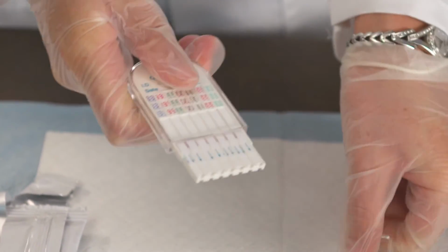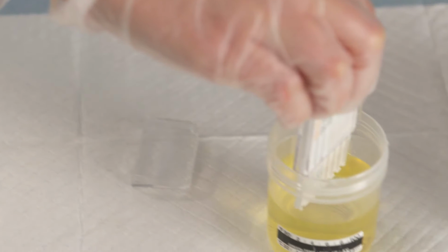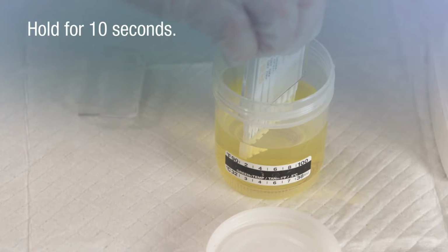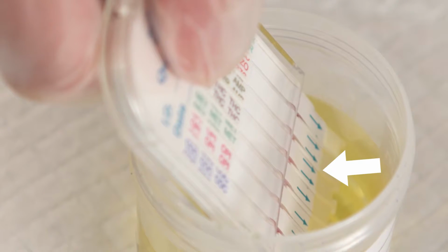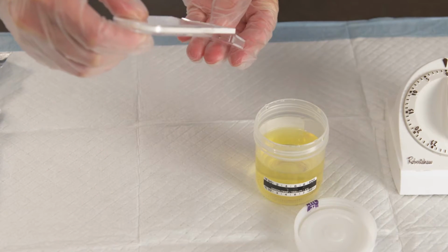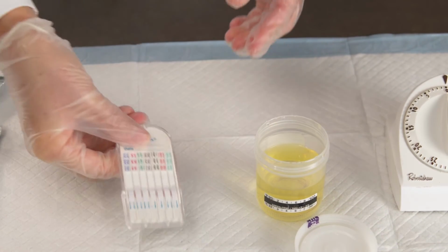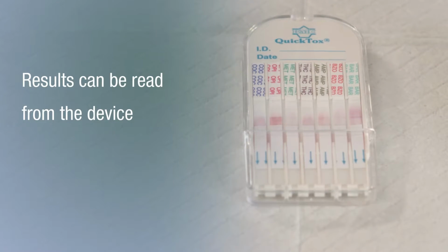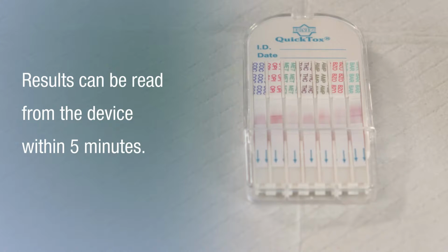Detach the bottom cover by pulling gently and dip the test card into the urine up to the tips of the blue arrows and hold for at least 10 seconds. Do not insert the test card into the urine beyond the arrows. Remove the dip card from the urine, reattach the bottom cover, and lay the device on a flat surface. Results can be read from the device within 5 minutes.